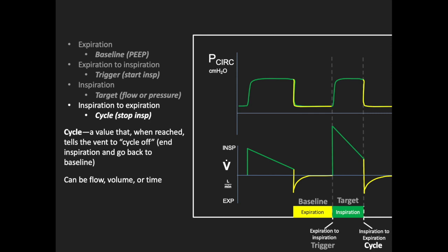And that could be uncomfortable. I mean, think about it. You're breathing in, and if you wanted to take a big long sigh and you could only get a certain amount of volume, it would be uncomfortable to suddenly have the breath end while you're in the middle of it. Or if the breath is only going to last a short time and you want it to last longer, that could be uncomfortable. Or say the breath is going to last a long time, but you want to cough in the middle of the breath and it's still pushing air into you, that could be uncomfortable.